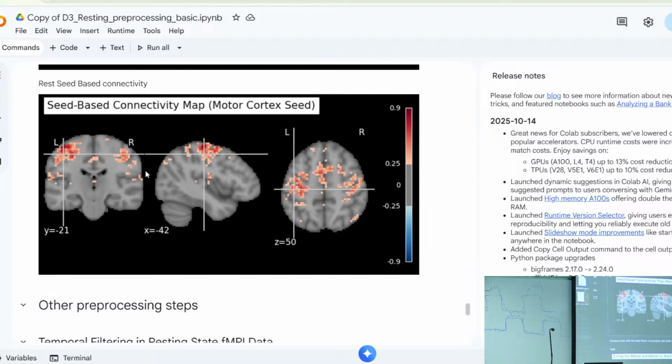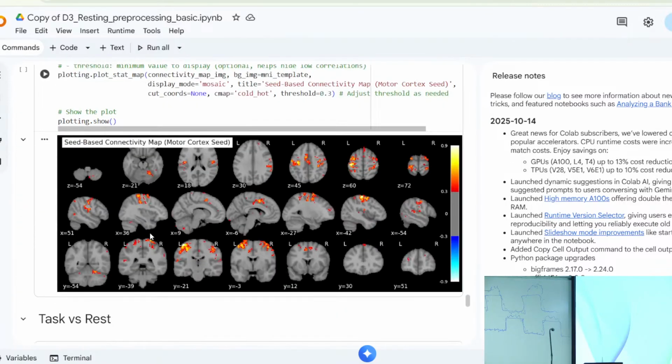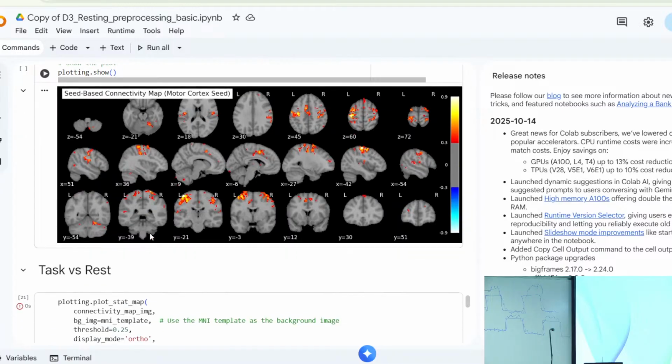There are ways to do it, but there is no easy answer. Because you're a physics major, have you heard of receiver operating characteristics, like false positives? If we really want, we have to use the ROC curve to best determine. A reference is from the mask, right? So there is an ROI from which we can find the mask, but there are other ways to find the reference also. I'll show you later.